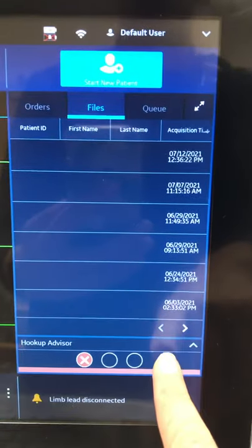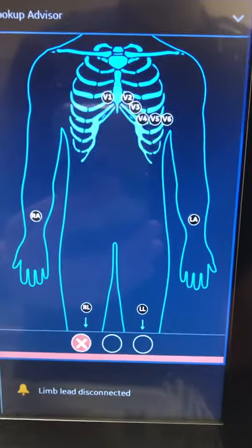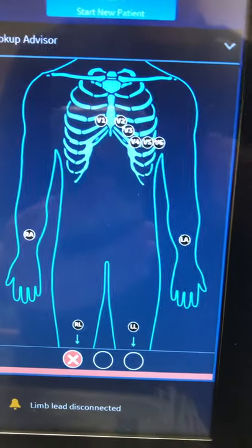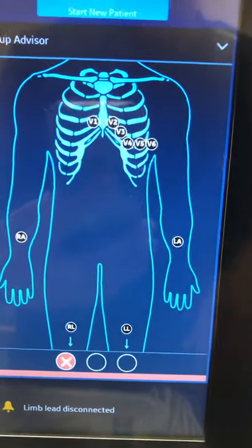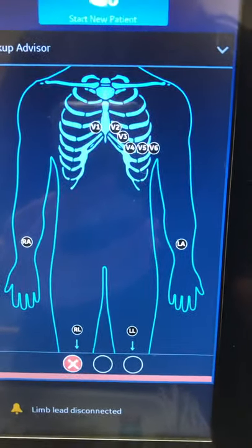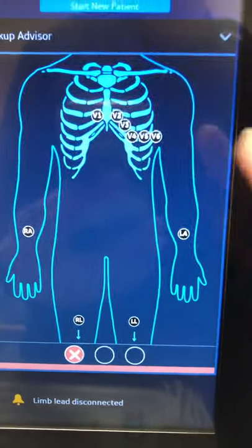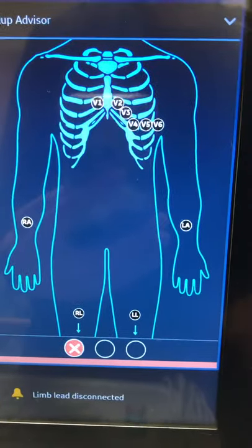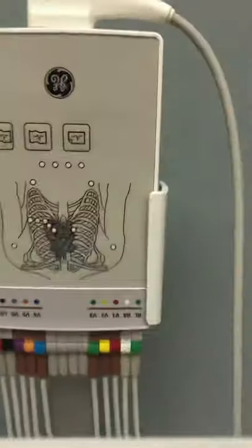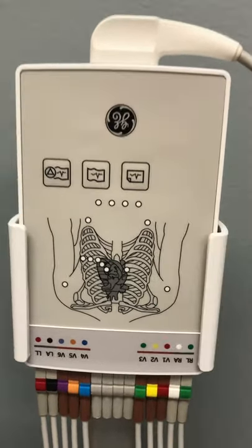You can also click on Hookup Advisor, and it'll bring up a picture. If you're not remembering where all your electrodes go — what is V1 versus V6, or right leg versus left leg — there is a labeled diagram of a person. If your electrodes are in the wrong spot, the individual dots will blink red; if they're in the correct spot, they'll blink green. Similarly, the lead box indicators will blink red if leads are in the wrong spot, or green if they're correct.